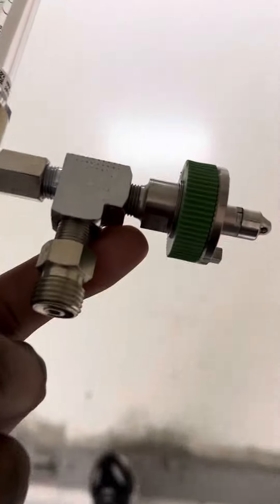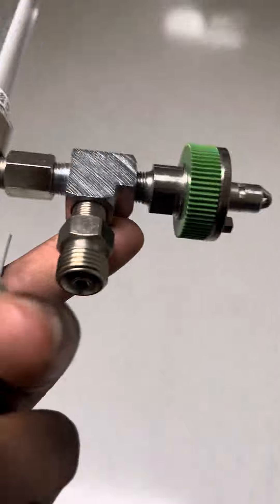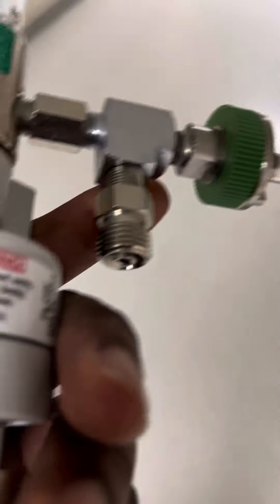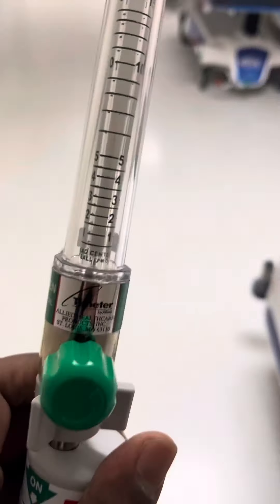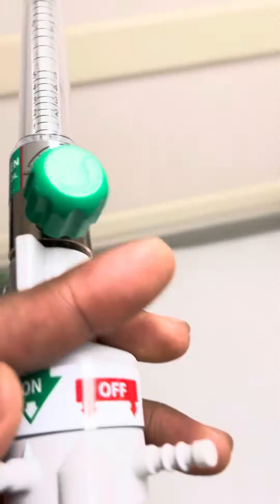Respiratory World. This is one of our dual setup flow meters — 50 psi connection for our BiPAPs. High flow, 50 psi set up for our quick connect to the wall unit.